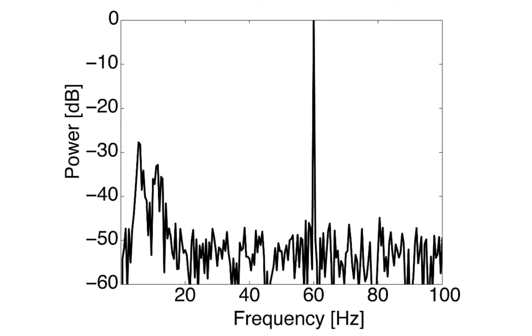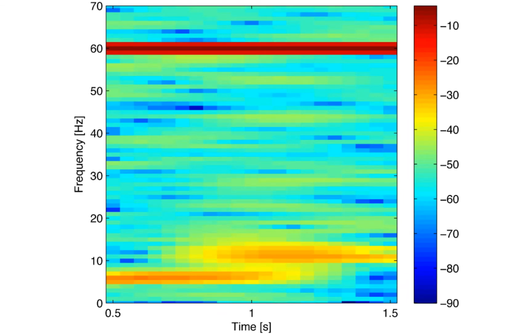We then considered how a logarithmic vertical axis can be used to emphasize features of the spectrum, and finally how the spectrogram provides insight into spectral features that change in time. We concluded that the EEG data are dominated by 60 Hz activity throughout the 2-second interval, and that weaker, low-frequency activity emerges during two intervals, a 6 Hz rhythm for the first second and an 11 Hz rhythm for the last second.